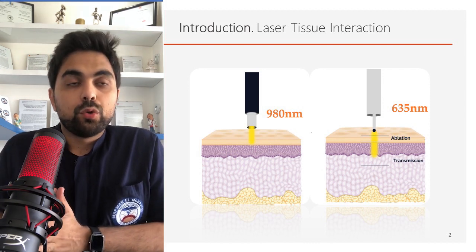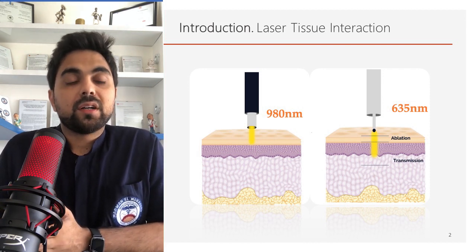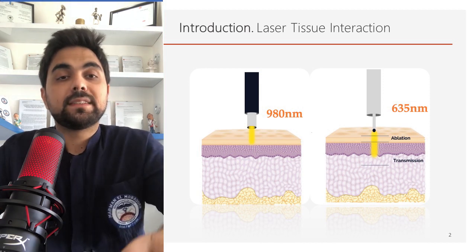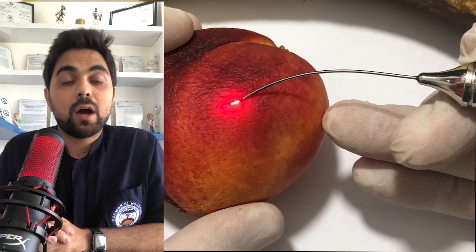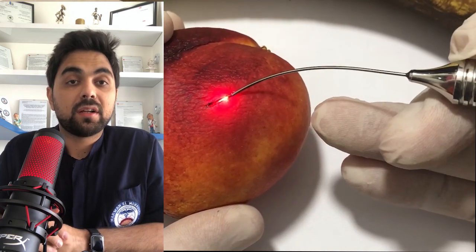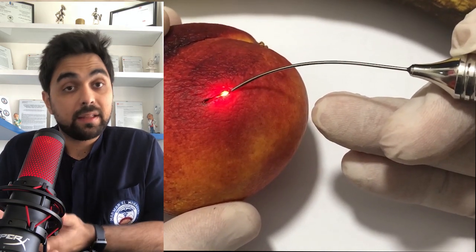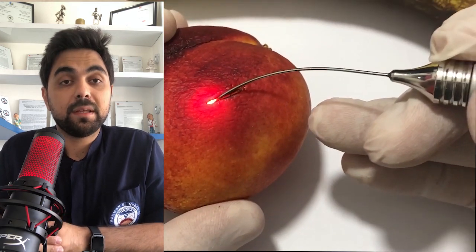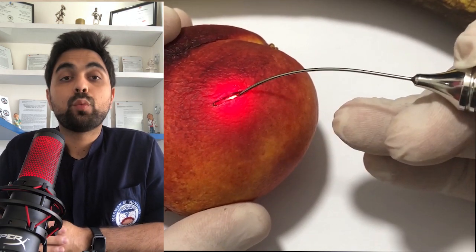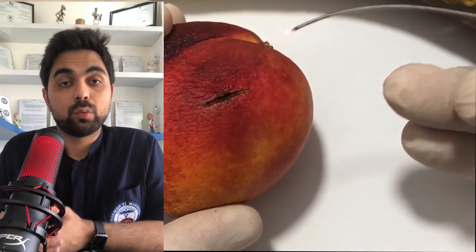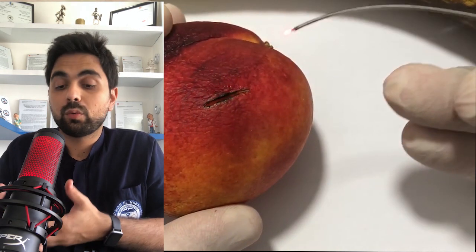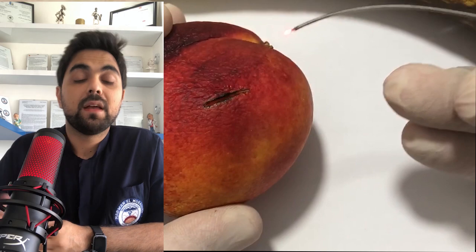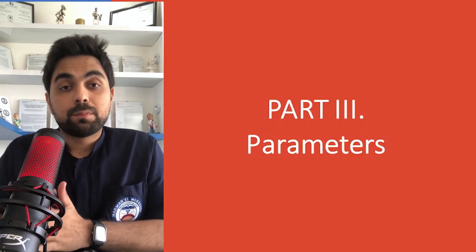Here I will show you the efficiency of the cut with the 980 nm wavelength. You can see clearly how clean the cut is and how it is fairly deep and very fast — because it is well absorbed in water, and you can see how the water vaporizes immediately.